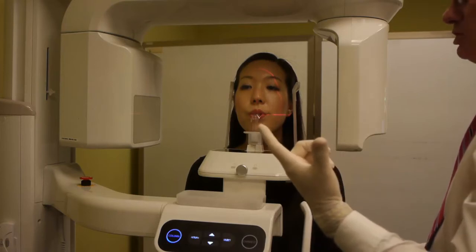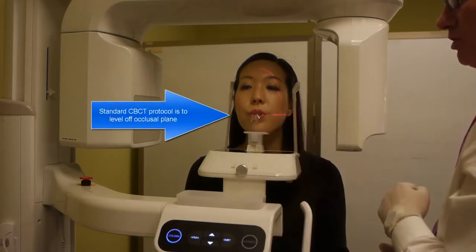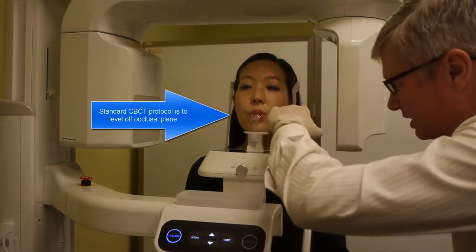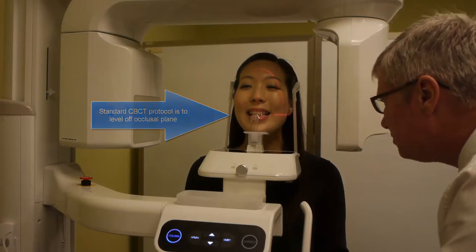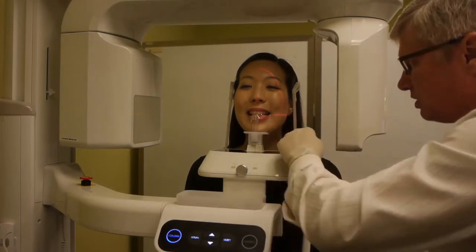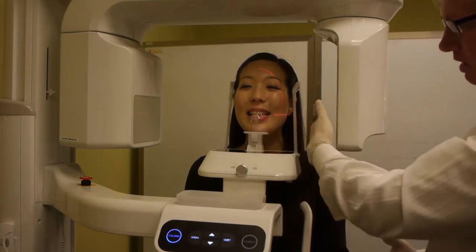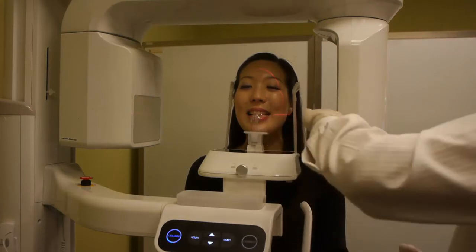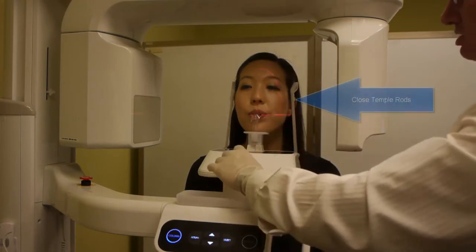There's one more thing we need to do here, though. Just like we did for our scan protocol, leveling off our occlusal plane, bring your eyes down to the same height as the bite stick, and if you would, go ahead and smile again for me, please. Okay, actually she's perfectly level right now. Technically speaking, the cusps of her teeth are parallel to that axial light, which works well sometimes as a reference. Once that is set, we can go ahead and tighten our temporal rods.